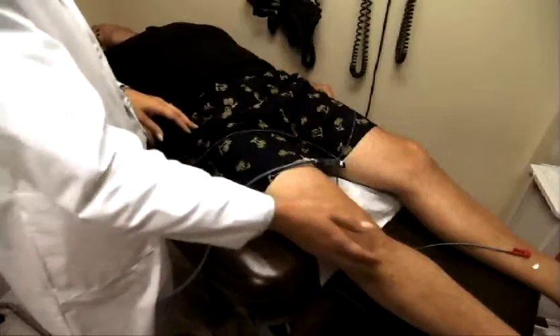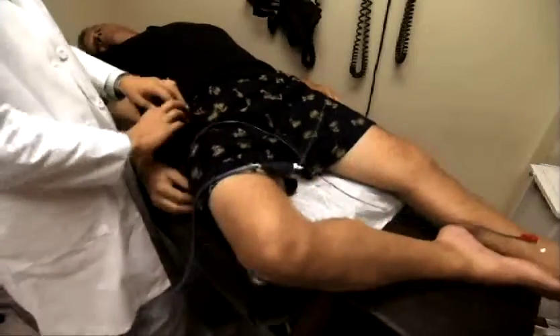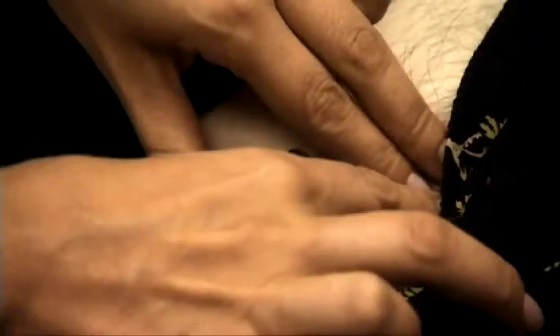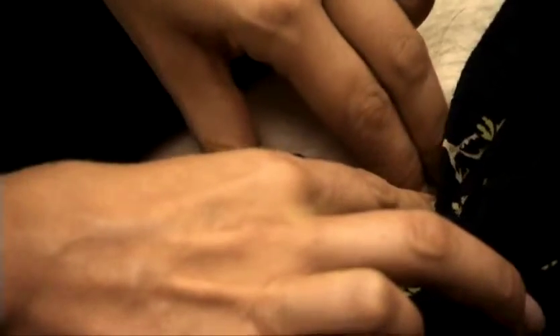Arrange the subject's clothing to expose the femoral artery. It may be helpful to position the subject in a frog leg position. Palpate the femoral artery and mark the point of strongest pulsation.